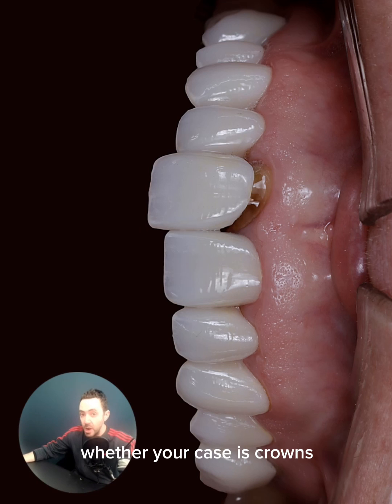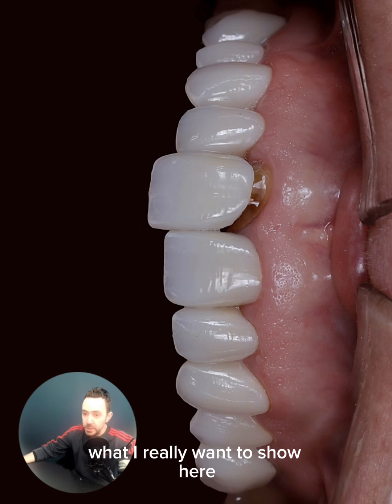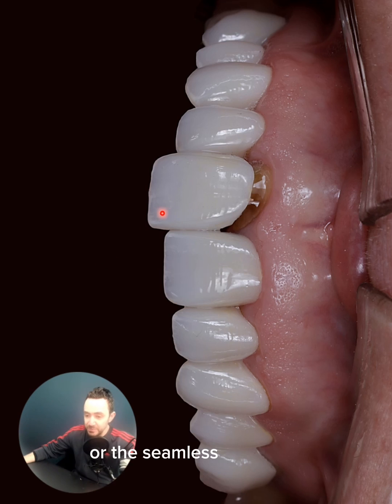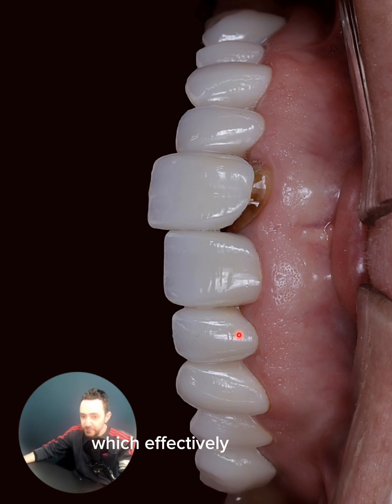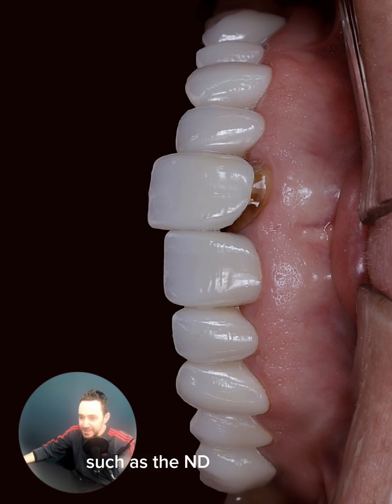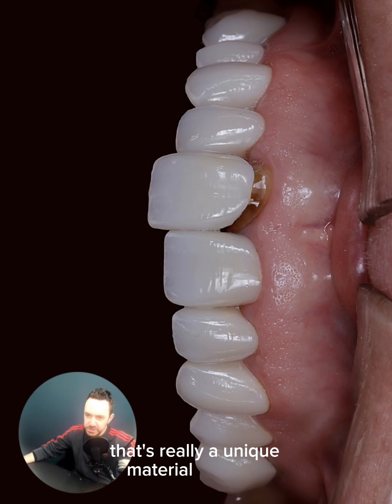Whether your case is a crown or veneer case, staining technique or even micro-layering — what I really want to show here is not just the real translucency at the incisal third or the seamless transition between the incisal and the dentin layer, but also the maskability of the dentin layer, which effectively serves in masking severe discoloration such as ND8 and ND9, and on a really limited thickness of just one millimeter. That's really a unique material property.